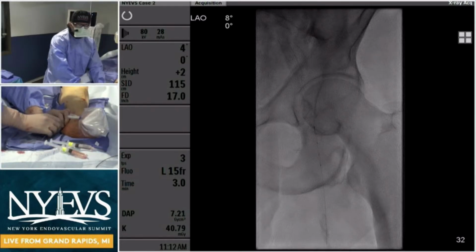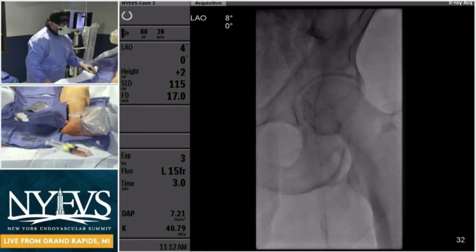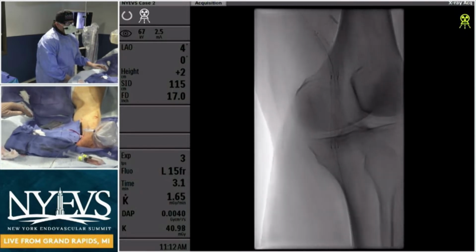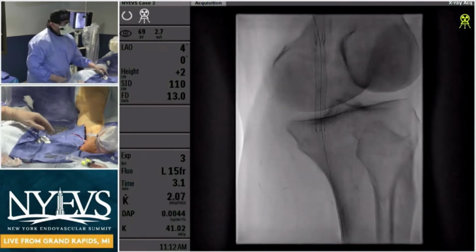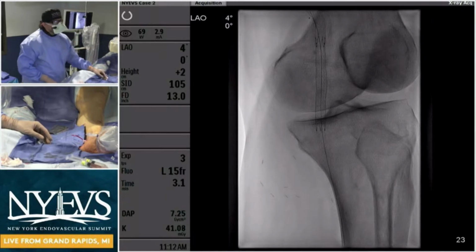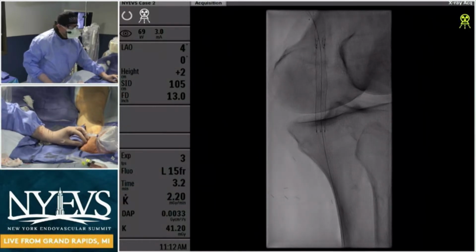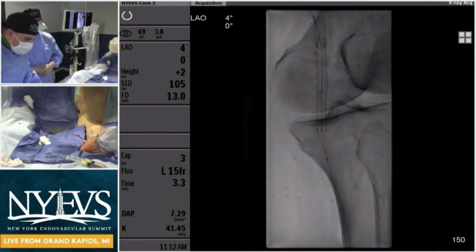Asma, what would you do? Anything different? So what I would do is what everybody said, either laser, but I was actually thinking laser maybe with adjunct primary thrombectomy, just maybe if it's a Lightning 7, for instance, just run the Lightning 7 or just Rotarex. Okay. So you've got a bunch of choices here, Fadi. So why don't you tell us what you're going to do?